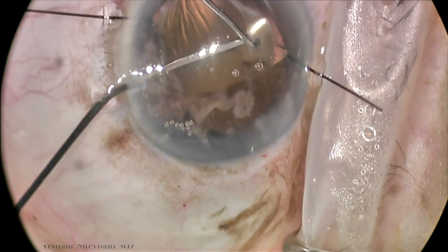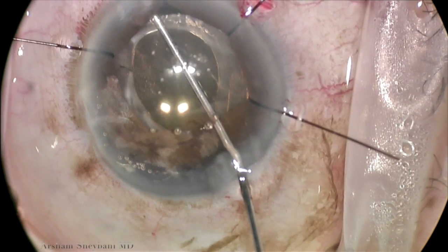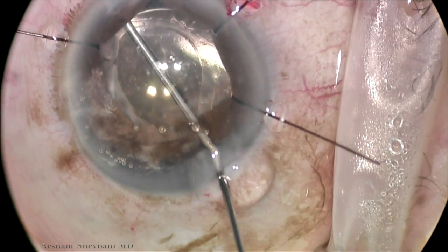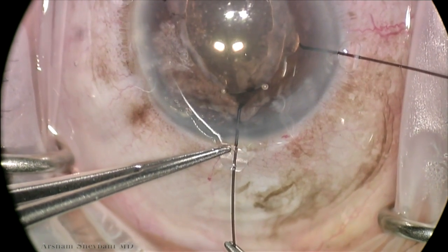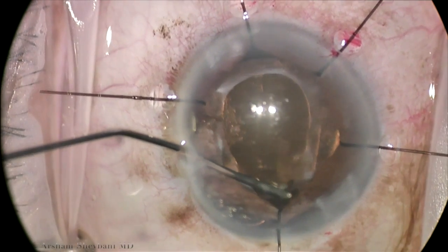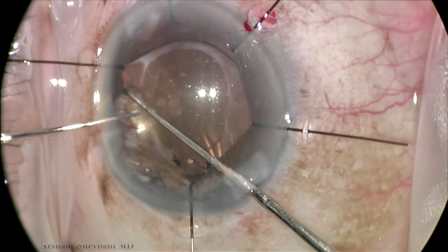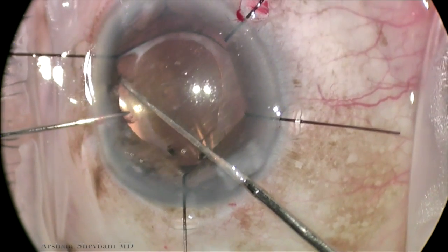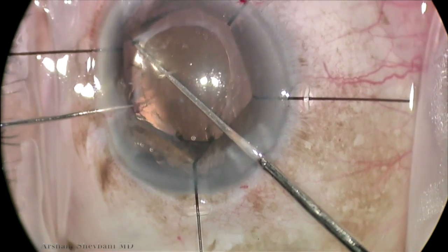What we want to do is dissect the intraocular lens from the capsular bag, but also to coat that posterior hyaloid face or vitreous. And now we're slowly going around the capsular bag and dissecting the capsule off of the intraocular lens. We use another iris hook here temporally where the iris prolapse occurred, and we actually found an area of anterior capsule runout. So that same area actually had zonule weakness or zonule dialysis.